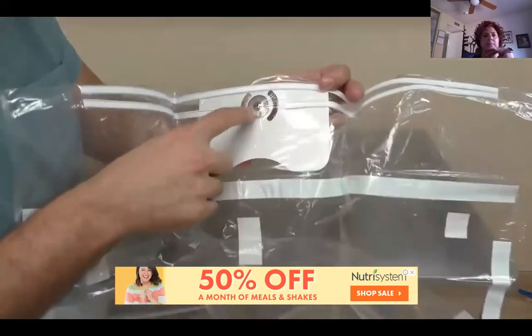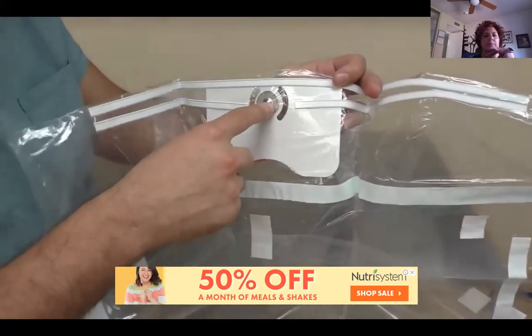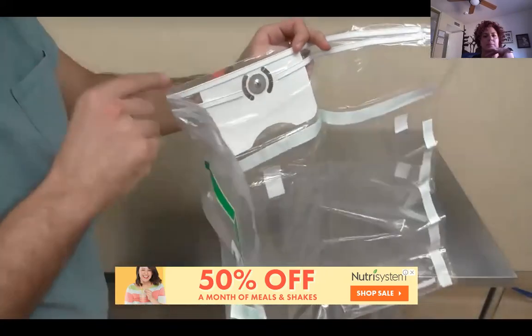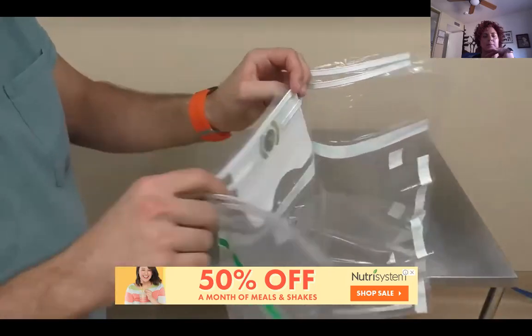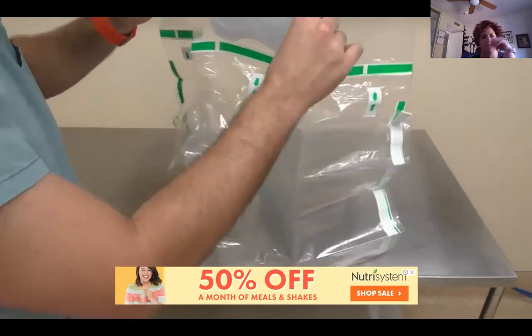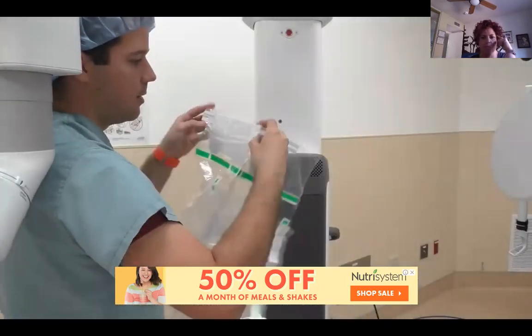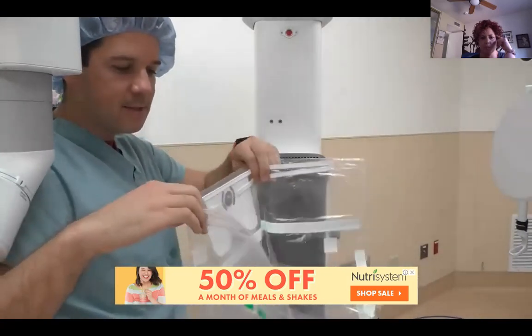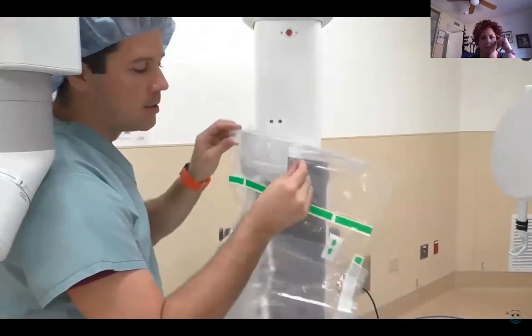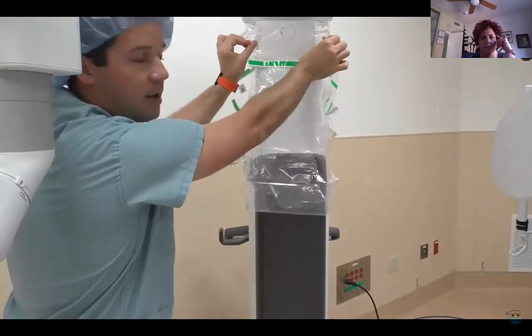And this is our magnet. This is the magnet that I was talking about, that it's going to attach to on the column or vice versa on the arms when we get the arm drapes. So you want to make sure that this is away from you, and I'm just going to place this right on the column. Hands are touching the outsides of the drapes. This already has a formation of a square to be able to go right onto that tower. So I just like to hold right underneath those and put it right there on the magnet.